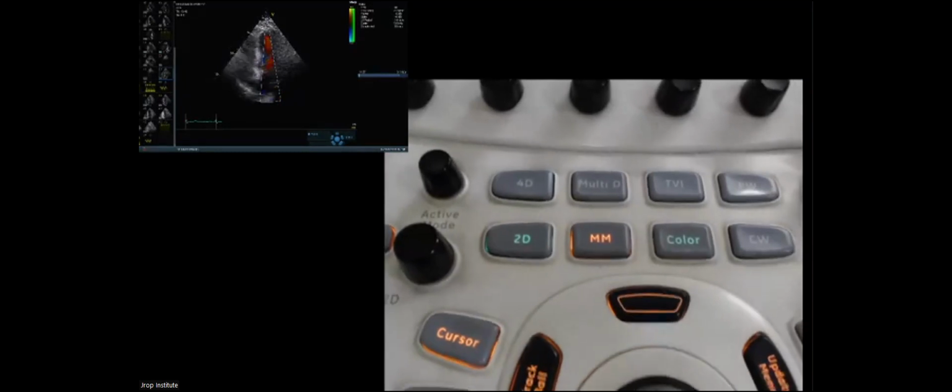So to begin with, if you happen to look at these knobs, you can blow up your screen completely. Once you blow up your screen completely, on the right side of the screen, you see this particular setup. On this side, there's a button with the name of 2 dimensions or 2D. If I press this button as a 2D, look what happens to the screen.